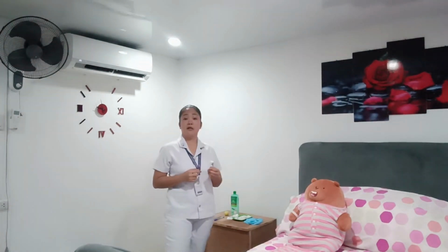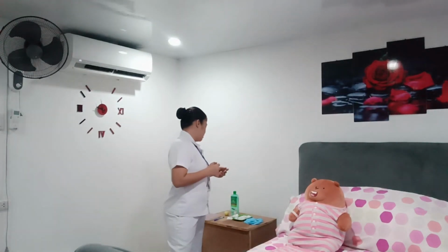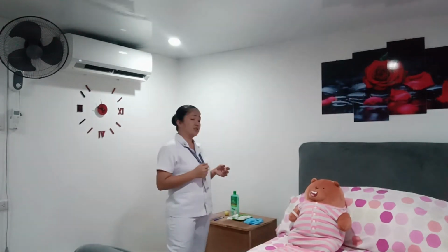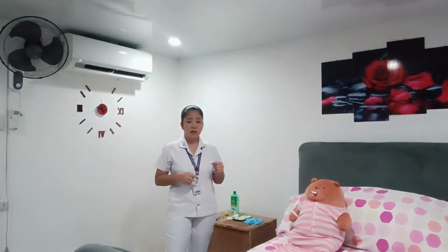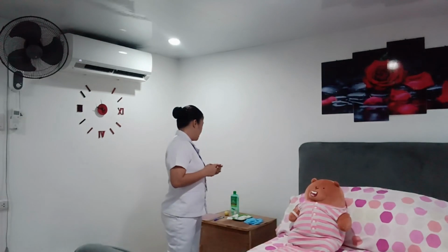Alright, now organize all the equipment that you need, which I have here. I prepared a 1 cc syringe here, and I also prepared the insulin syringe just to show you. And I got a couple of cotton balls, the band-aid, and the antiseptic alcohol pads to clean up the area of my client where I'm going to inject.